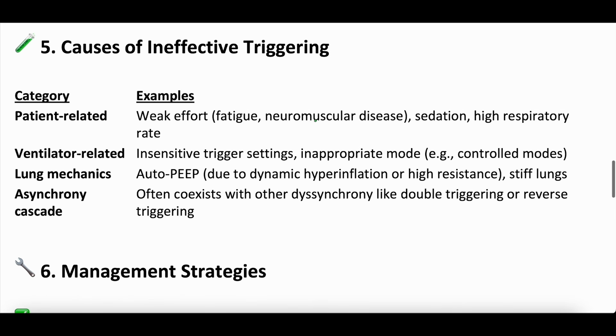Causes, if we dive more into it, as we mentioned, patient-related causes: weak effort from fatigue, neuromuscular disease, sedation, too high a respiratory rate, so they're tired. These can all lead to ineffective triggering because they can't mobilize that flow or pressure to trigger the ventilator.